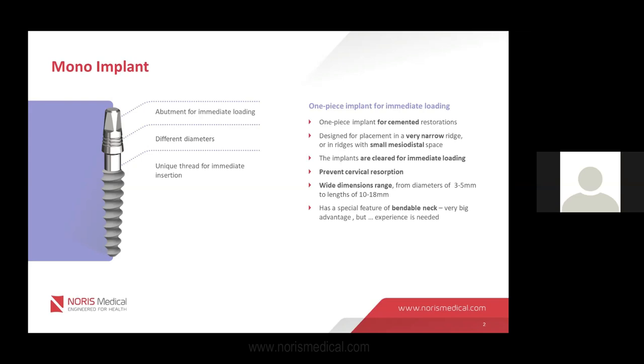I think that the main advantage of the implant is that it doesn't have a connection between the abutment and the implant. So this prevents all the bacterial leakage that can go between the abutment and the implant. Because we have to consider that even when the abutment and the implant are tightly closed, in the mouth and under pressure, it all the time works. The bacteria accumulates there. And as to literature, and in my opinion, as a practitioner of more than 20 years, the bacteria harms the bone. So when everything succeeds and everything sits well, there will be very, very slow bone loss. So this is another advantage of the implant.